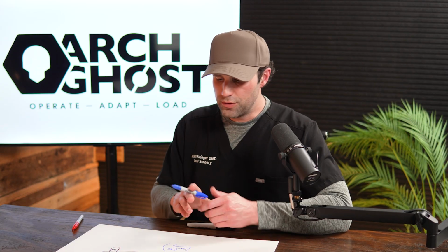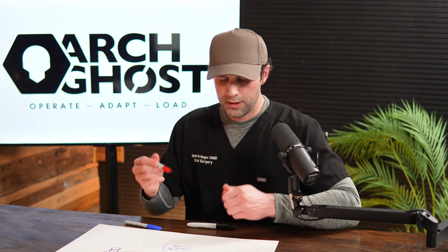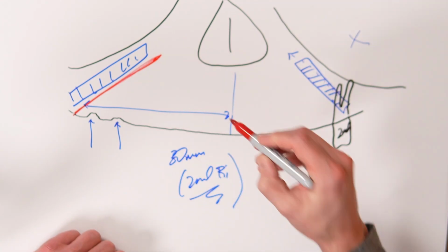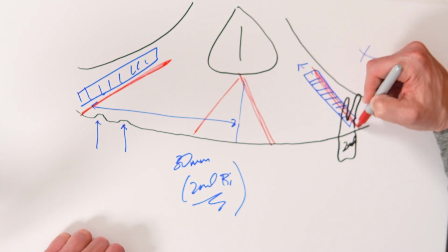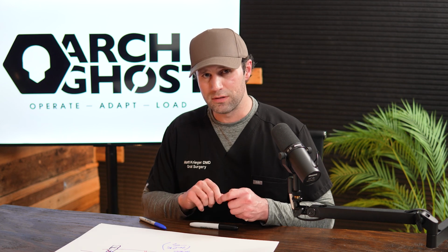Now, here's one key, though. When you're going to use this technique, what you've got to do intraoperatively is you've got to draw your implant line, and I'll say this is my sterile graphite device. I'll draw my implant positions here. Here I do a modified V4, and I'm going to do it here at this socket, okay? Now, I'm going to draw those lines clinically with the sterile graphite device before I perform my reduction.